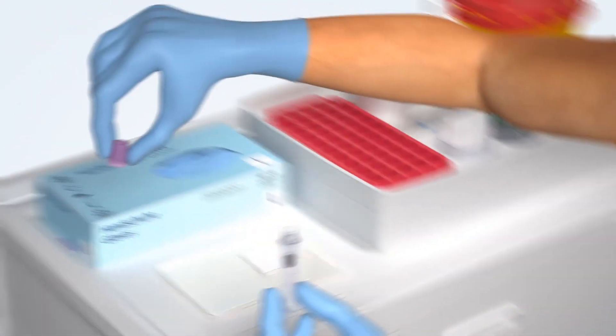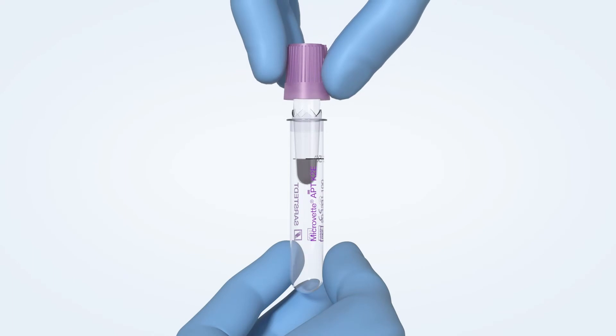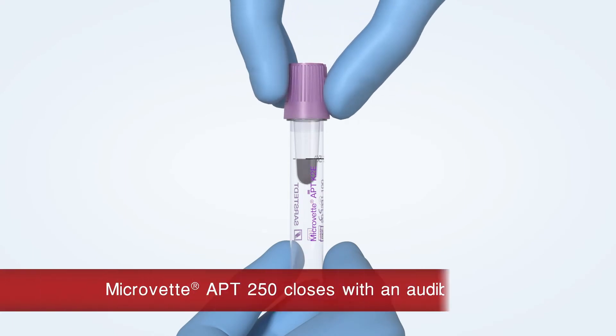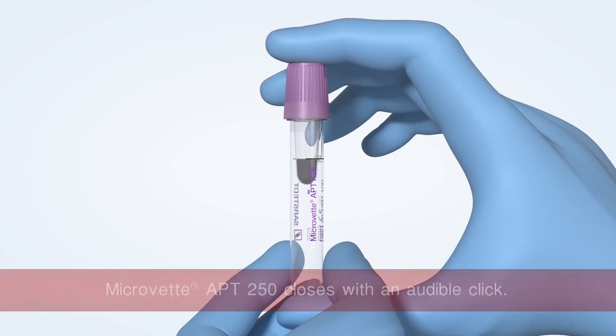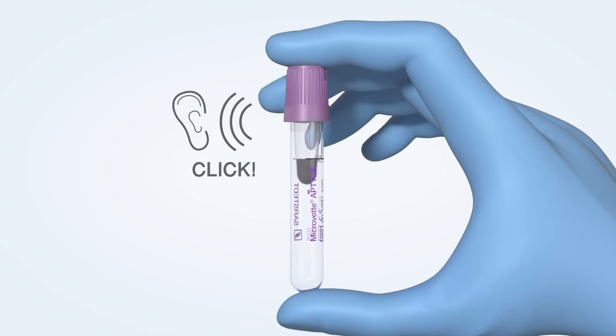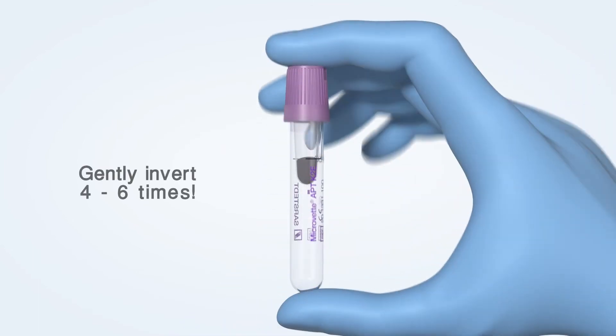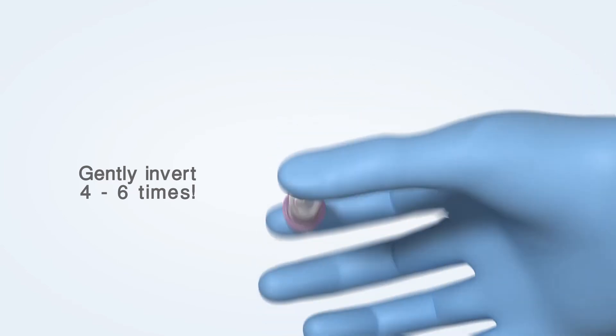Take the cap and close the Microvette APT with an audible click. Gently invert the Microvette APT four to six times.